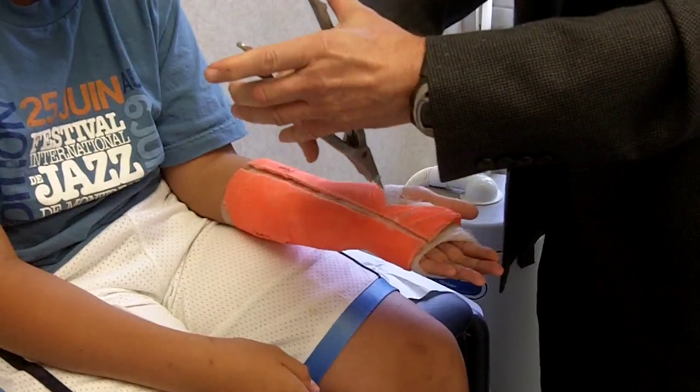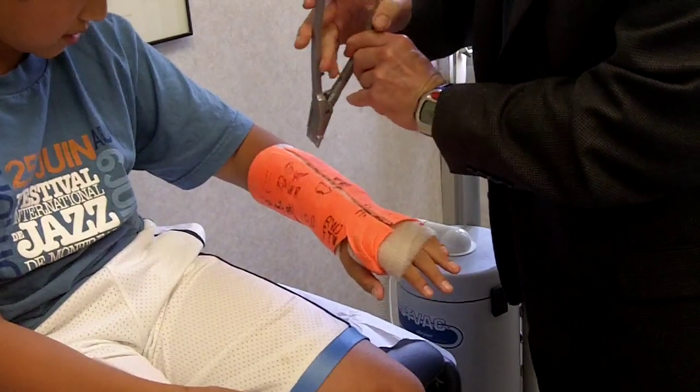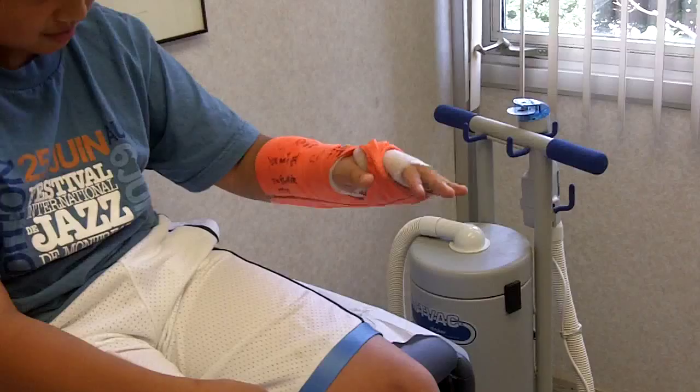Put it in there and put it on the side. Not done yet, we're getting closer though.